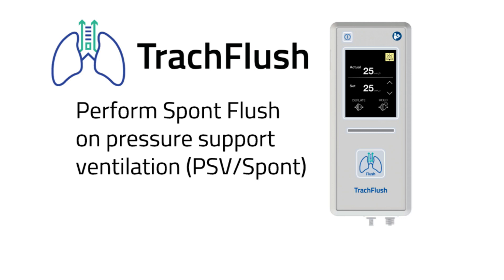Welcome. In this video we will demonstrate how to use the spunt flush on a pressure support ventilated patient.